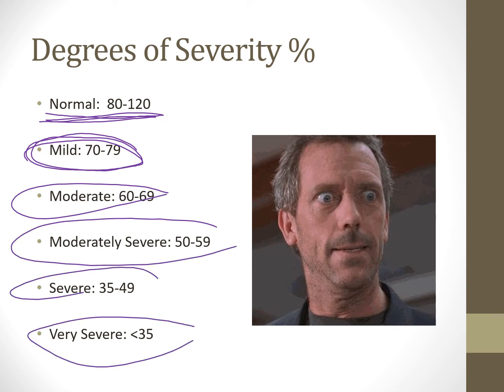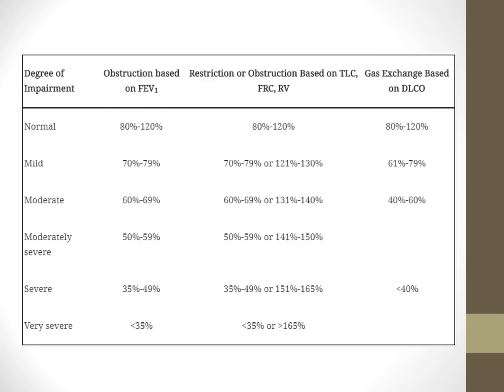We had a patient that had cystic fibrosis and was in her 3rd trimester of pregnancy. So not only were her flow rates low, her volumes were extremely low, and she was at 22%. Crazy. And she did great. Awesome. So when we're looking at something like this, that's how we determine the severity. That previous patient, the example that we talked about, that 78% would be a mild restrictive effect.